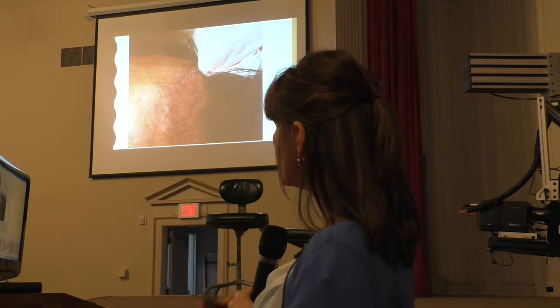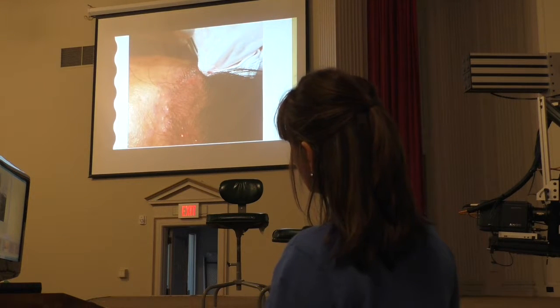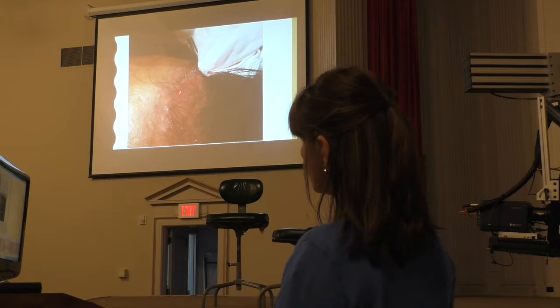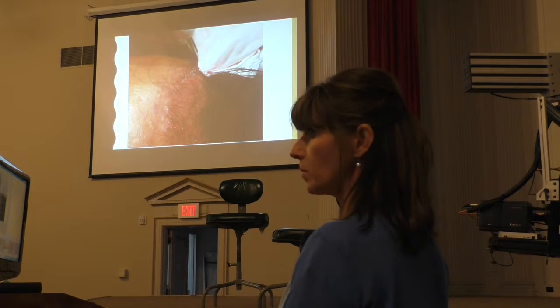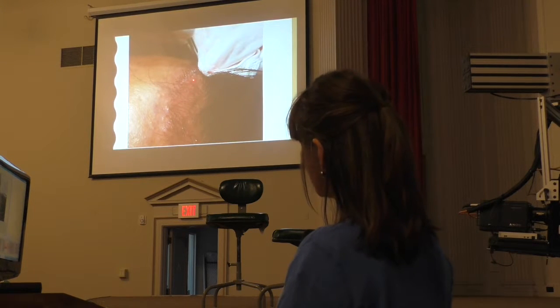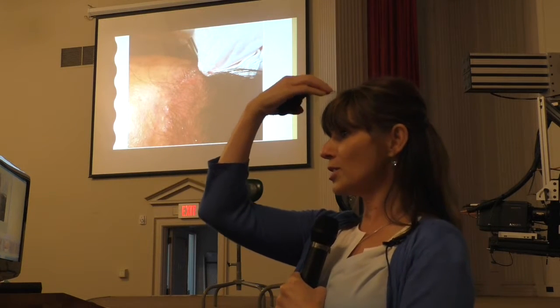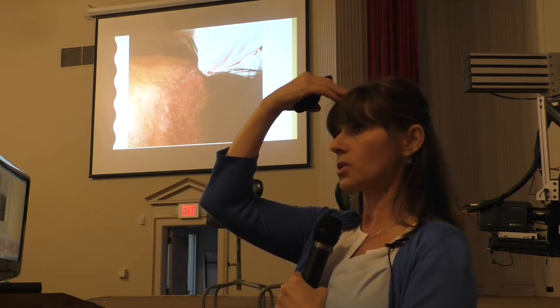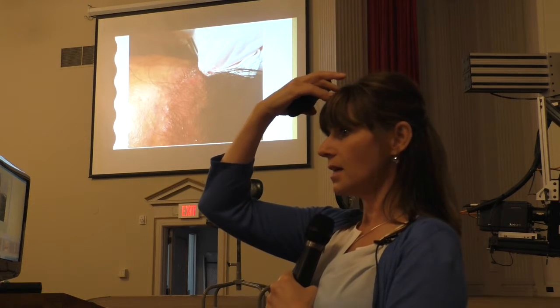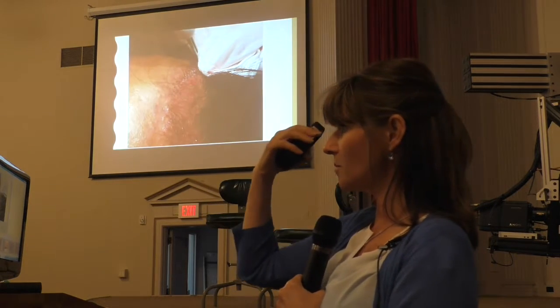During placing, there has to be communication. For example, these two assistants are moving from outside in, not realizing that this is a critical portion to be placed. You place this first because of the blood supply. The second thing, this is the area that has the core density, so you want to make sure that you have enough graft. If there's any chance of miscalculation and this is missed, it's going to look like horns and not enough hairs in the middle, right?